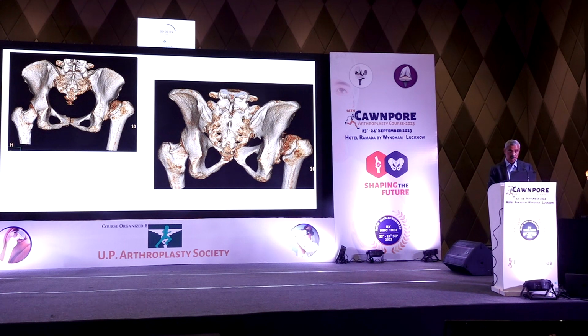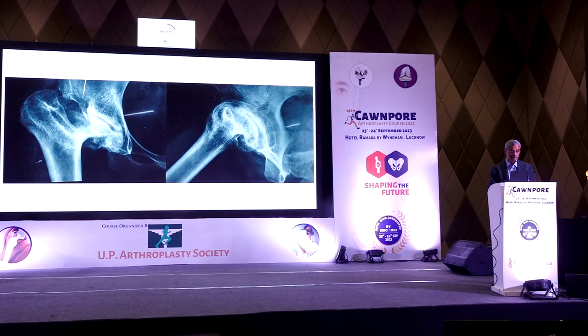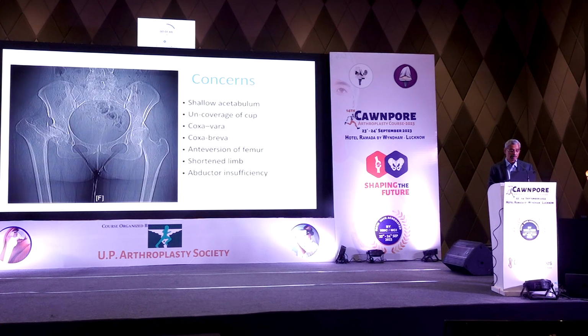As you can see that the posterior wall is deficient, so is the anterior aspect as well. So you plan to deepen this and go down to the teardrop. If you do that, then you will probably get a small cup all the way in, without having to resort to a big cup, or you may at the most get to use a bone graft or a wedge.